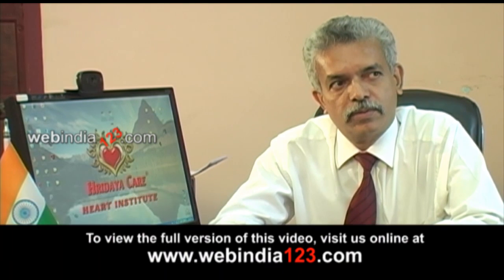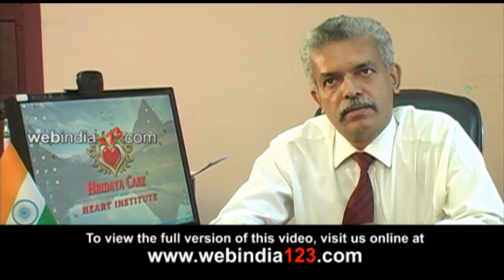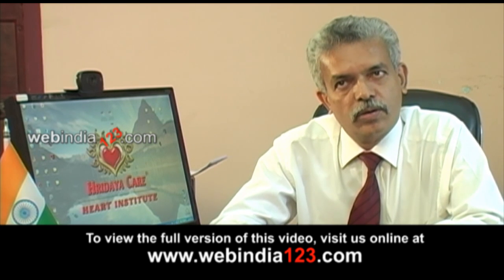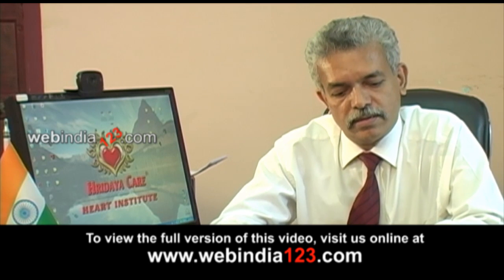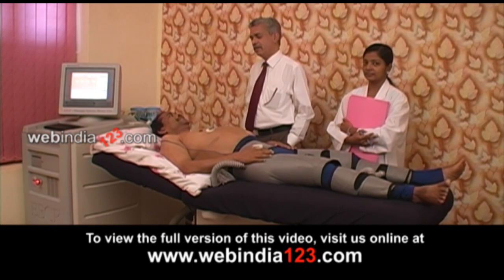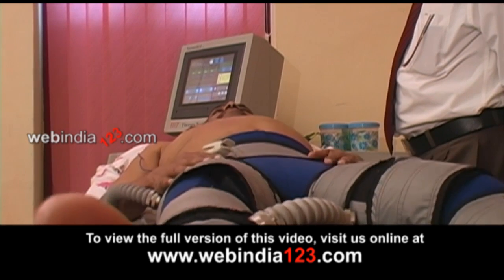EECP is a short form of enhanced external counter pulsation. The procedure actually supplies blood circulation to the heart, brain, and other organs during the period when the heart is not pumping and the heart is at rest. The blood from the lower limbs and the buttocks is pumped back to the heart through the aorta during the time when the heart is not contracting — the relaxed time.